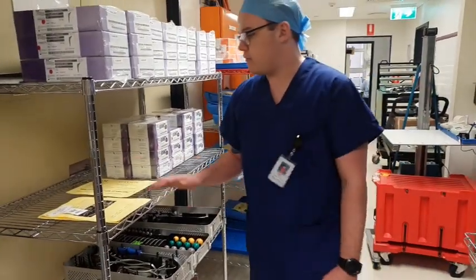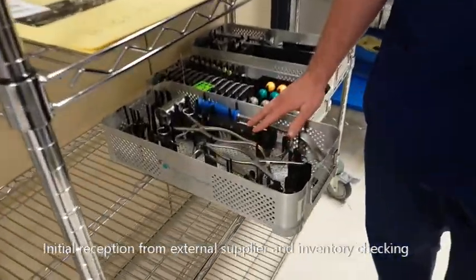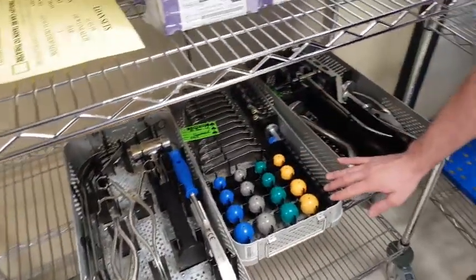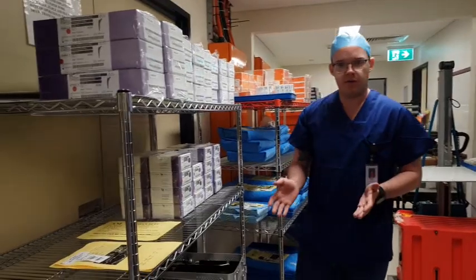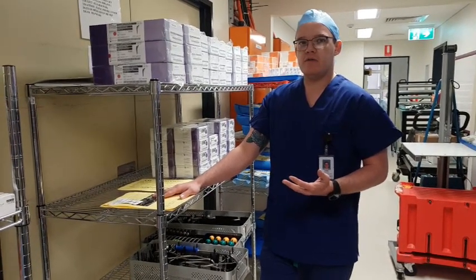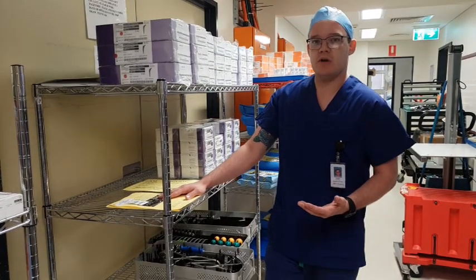Yeah, so basically with the paperwork that the company's provided, we will inspect every instrument that you can see on these trays here. They have serial numbers and lot numbers just so they can be clearly identified. Essentially we will tag these trays for clear identification, so we know who they're being used on, who will be using them, and what date the operation will be taking place. We will tag paperwork with special tags for our tracking system so that it may be identified later on, to see who has handled it, if and when it's been sterilized, and to ensure that it has passed all of our sterilization parameters.